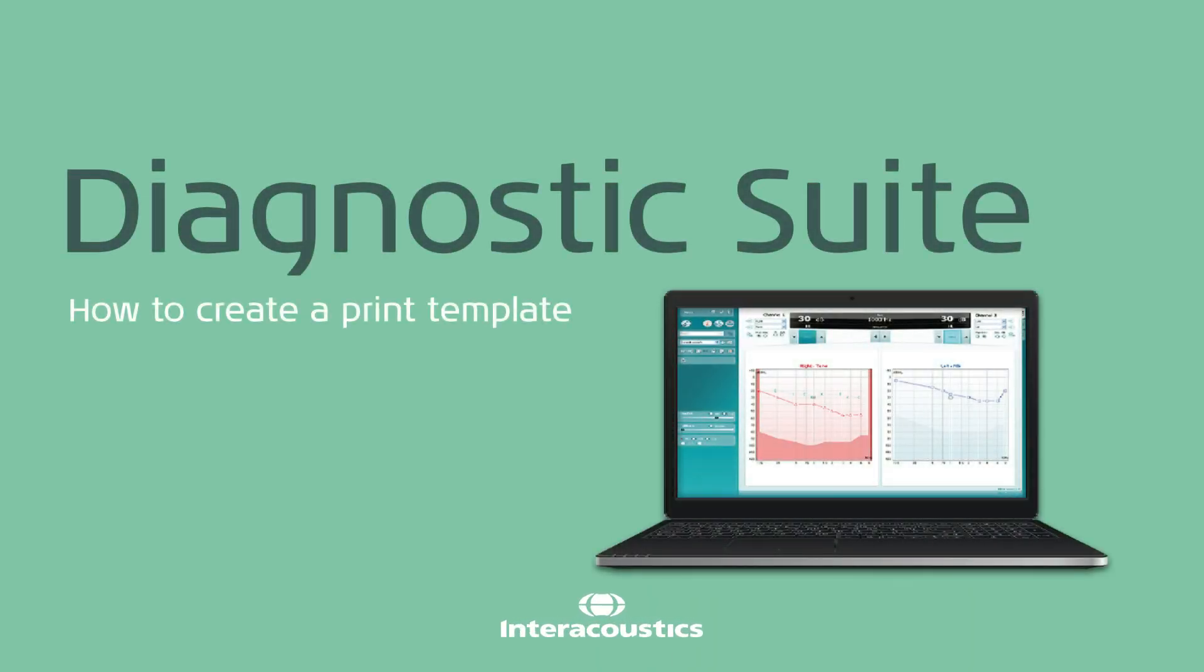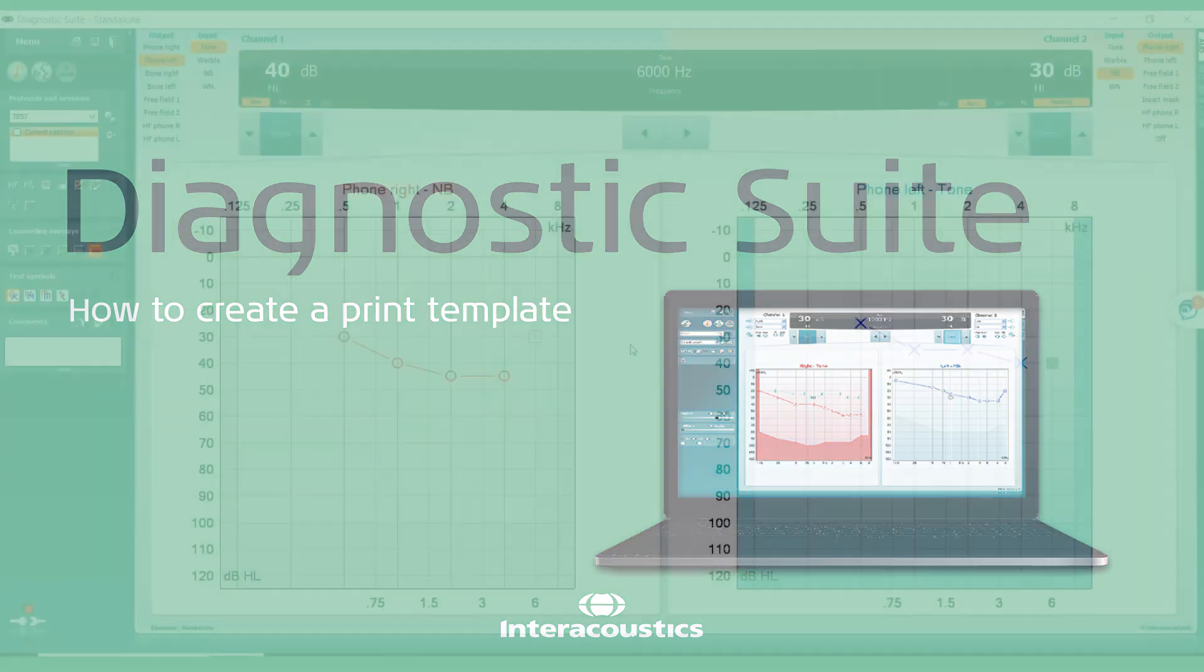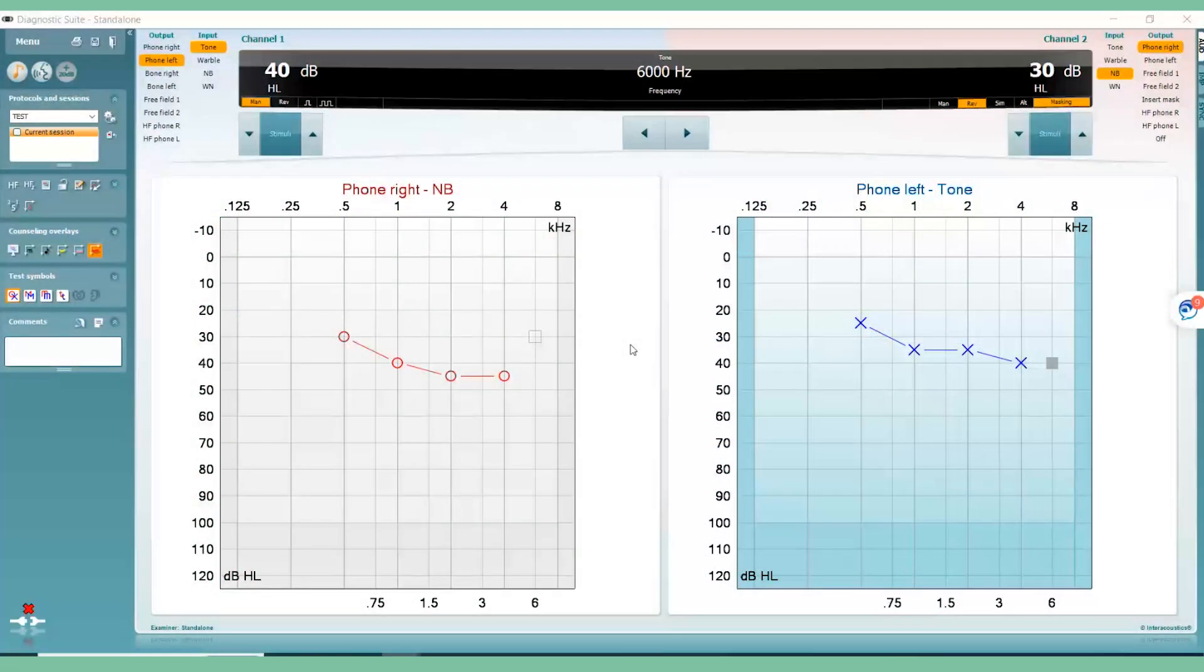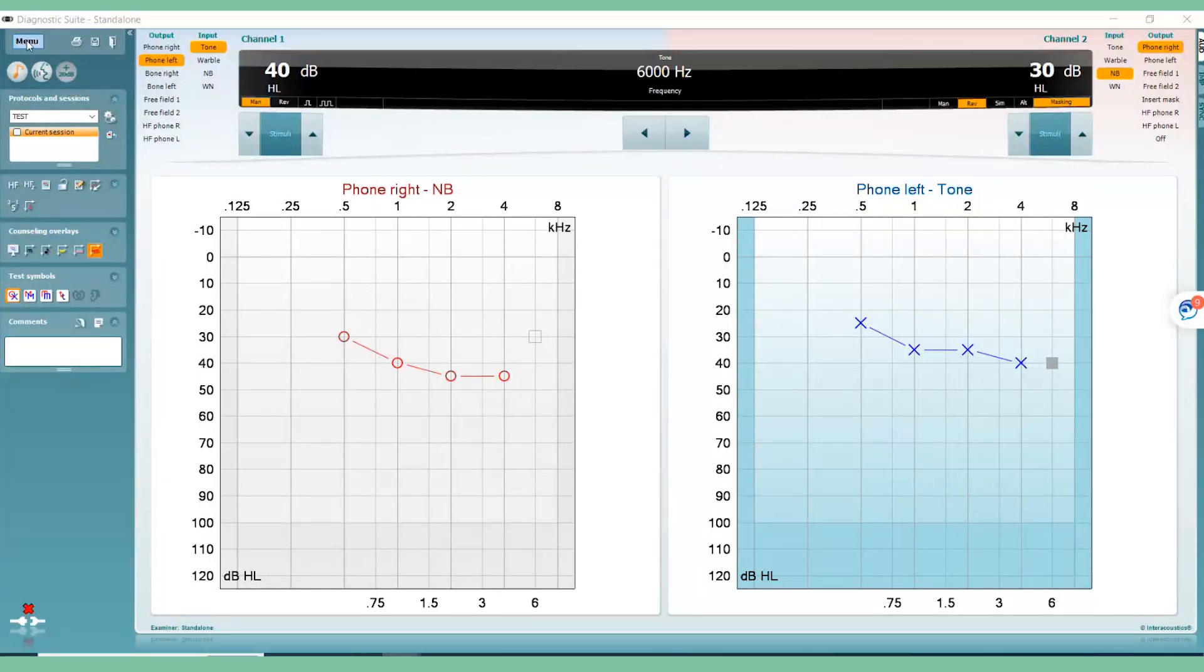This video will show you how to create a print template in the Interacoustics Diagnostic Suite. In any of the Interacoustics Suite software, you have access to the Print Wizard. The Print Wizard allows you to create templates for your test results to print out.